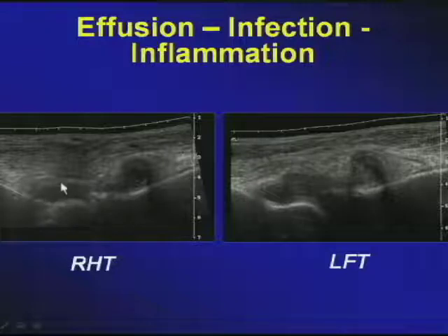Case in point, you'll notice that they are near symmetrical. First, let us address the bone acoustic landmark. Here you see the round capitellum and the flat head of the radius along with the radial neck. Anterior to this, you'll see that the capsule is not only distended, but within the intraluminal portion of the capsule, you'll see this intermediate echoes and thickened lining representing not only the nodular synovitis, but also proliferative synovitis that's occurring with this individual.